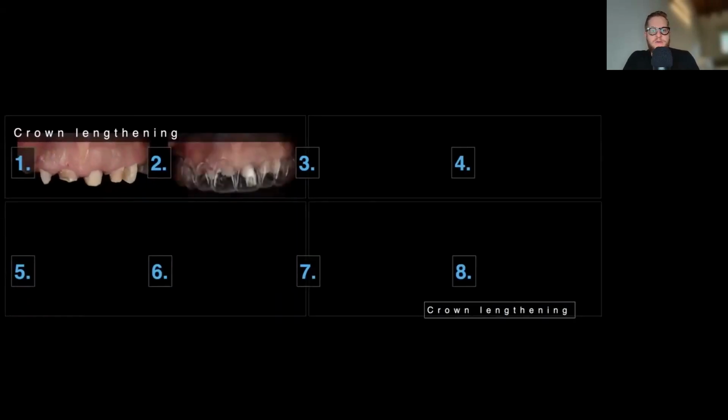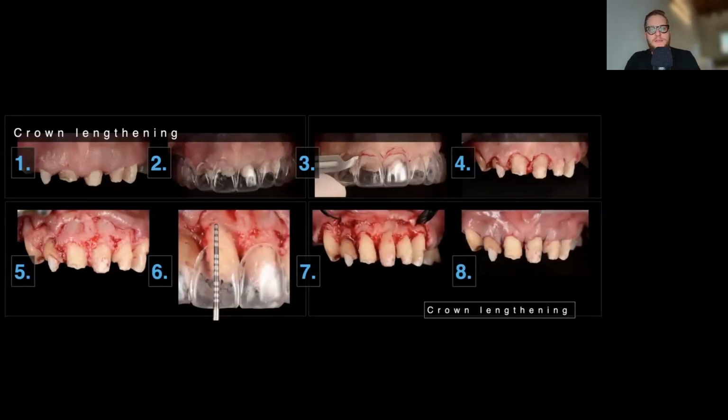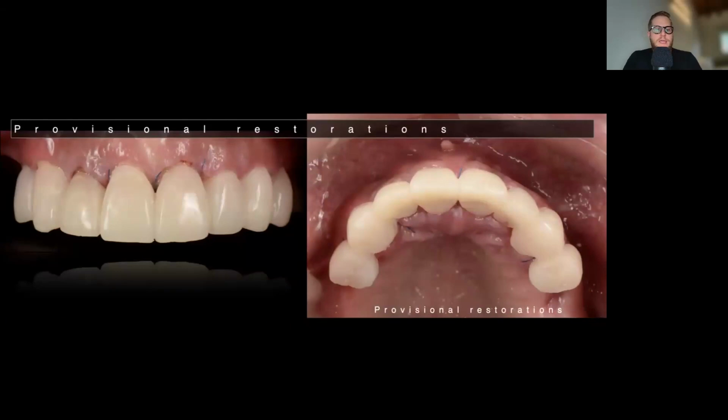And as you can see, we decided to go for option A. So we wanted to save those teeth. So we went through the process of crown lengthening, and it was an open flap crown lengthening because it was a lot of structure that we needed to get, and we had very good keratinized tissue, so we were comfortable using this technique. And this is what we have.